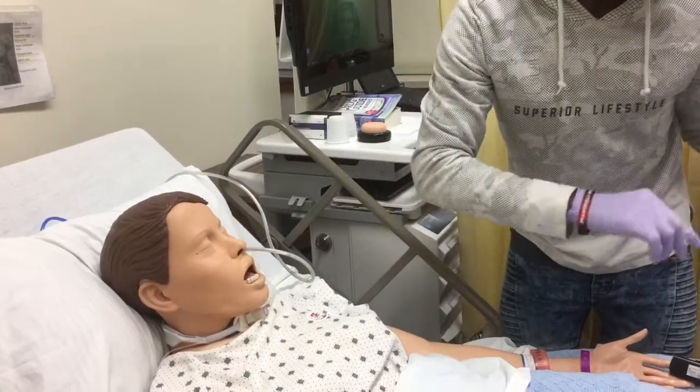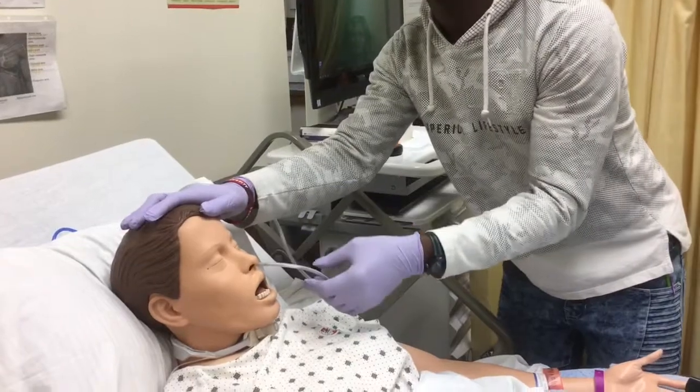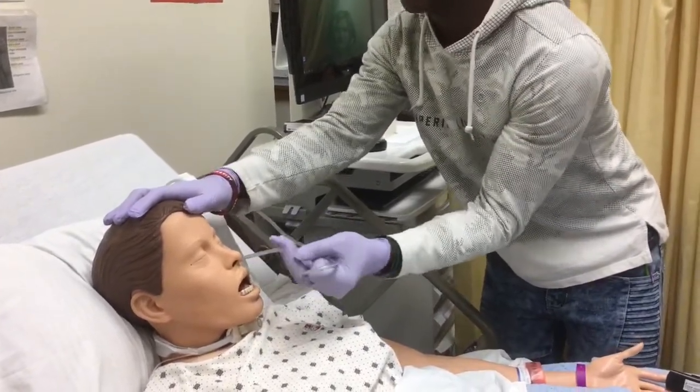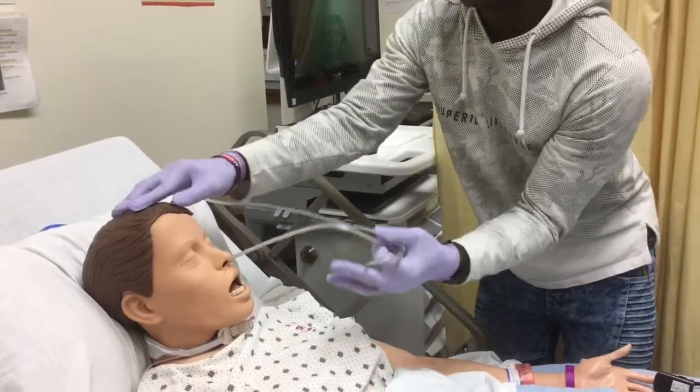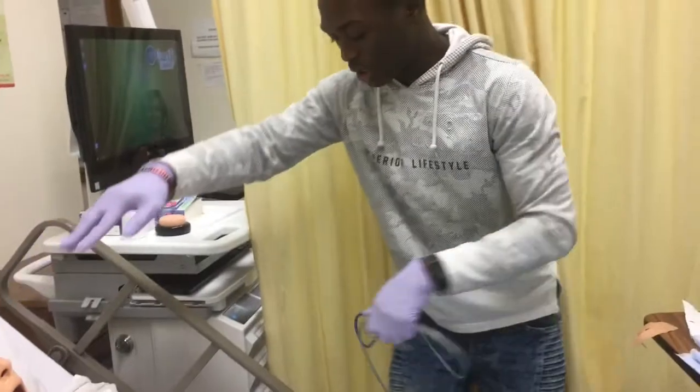Okay, and now you're going to ask the patient to take a nice deep breath for you and hold it. That provides relaxation of the muscles, and you want to remove the tube as fast as you can. Okay, and you can put this in the trash.